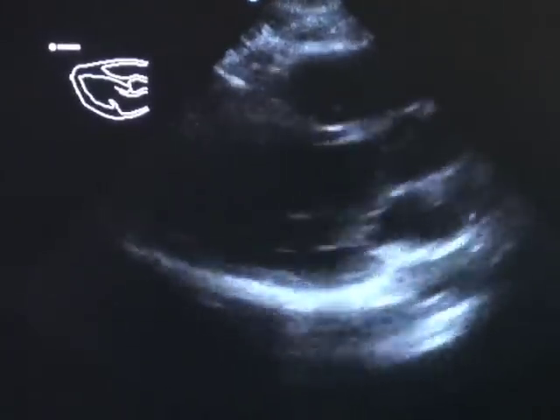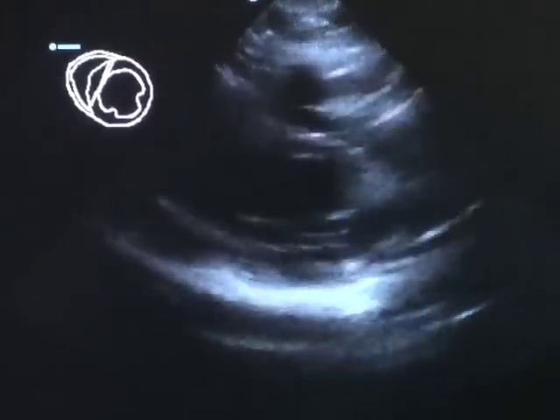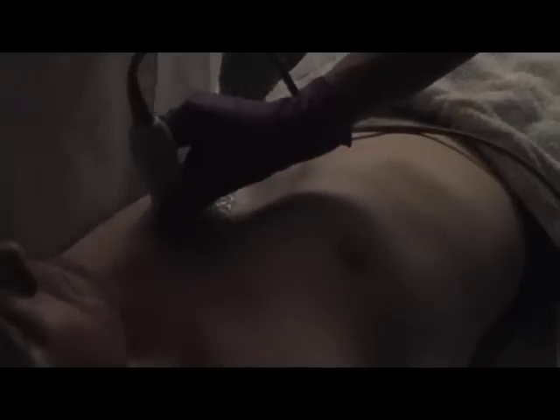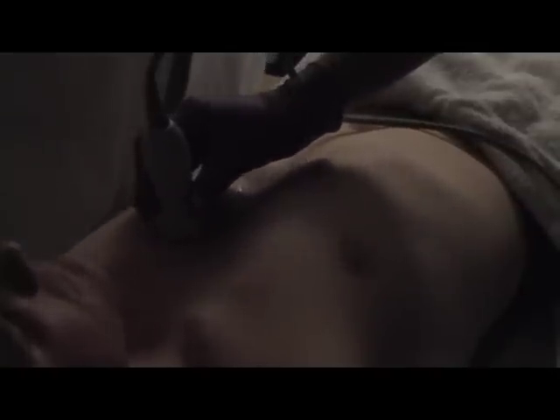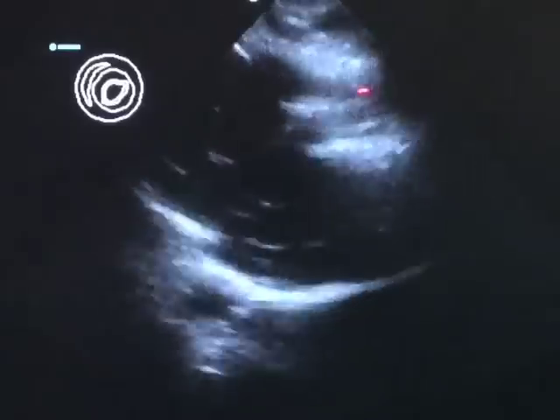As Dr. Kuby switches to the short axis, she'll change her pictograph. She'll rotate the probe 90 degrees, now with the probe pointing toward the right hip. On a plane from the left shoulder to the right hip, she's still in the parasternal short axis. We can visualize the short axis.